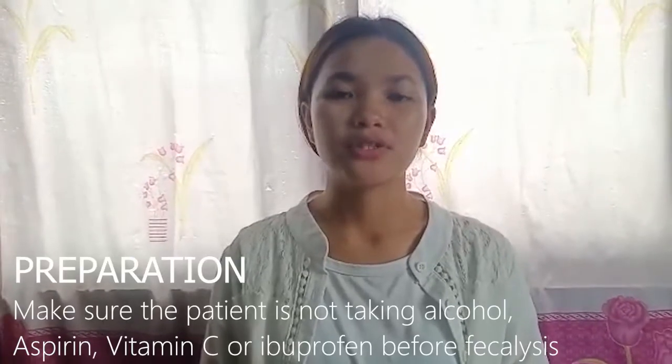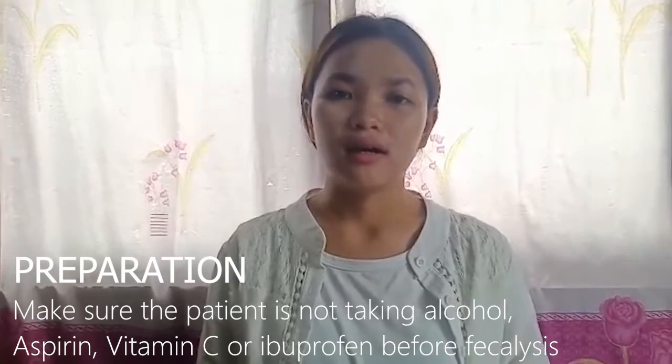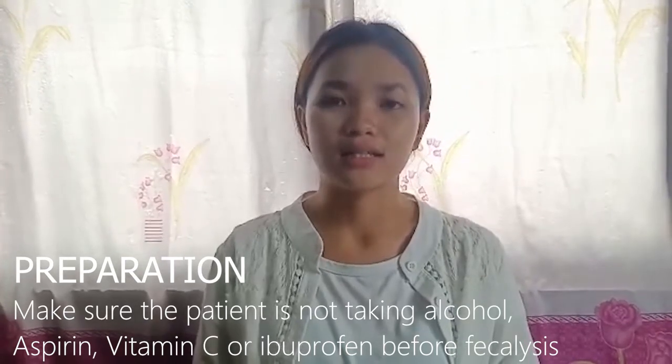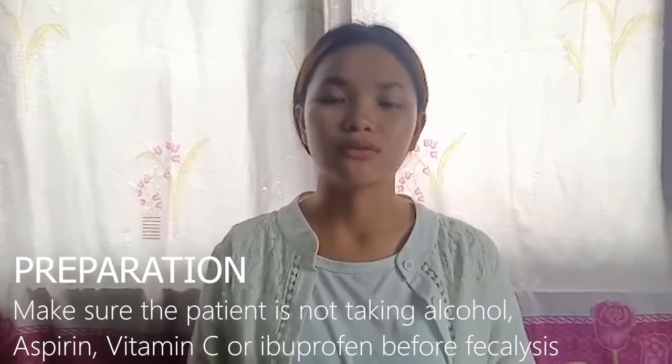My name is Anna Rose Ebora from BSN 1Y2-16, and I'm here to discuss the stool collection procedure and what to instruct the patient for stool collection. So, in preparation, make sure that the patient is not taking any alcohol, aspirin, vitamin C, or ibuprofen before the fecalysis test or during the routine fecalysis test, because these substances may alter the result of the test.